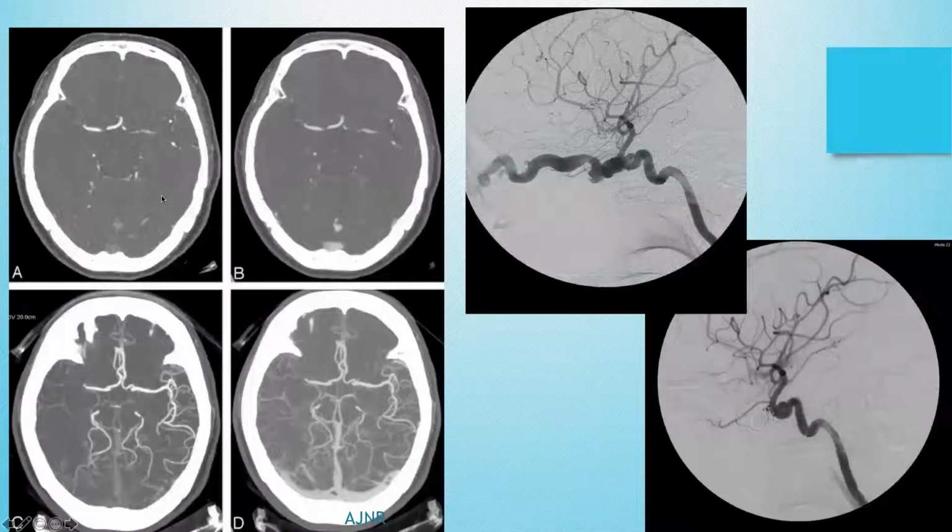So now we get on to more detailed studies. So this is a CT angiogram, which you could do for patients who presented with subarachnoid hemorrhage to locate where the aneurysm is. And here you have the early phases of the study. Actually, here you can see a saccular area in the right middle cerebral. These are later phases, and you now start to see the veins filling up, the sagittal, the transverse, straight sinus. So you can do CT angiography, CT venography.